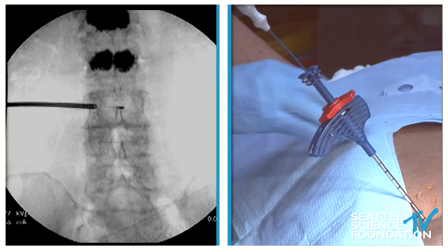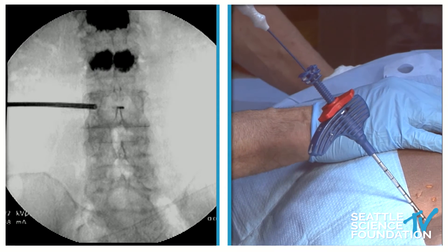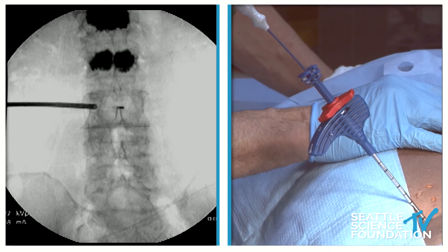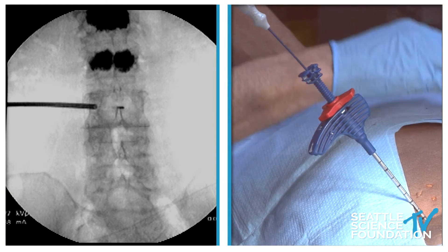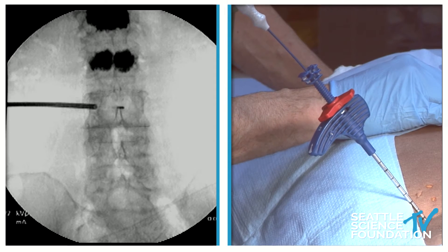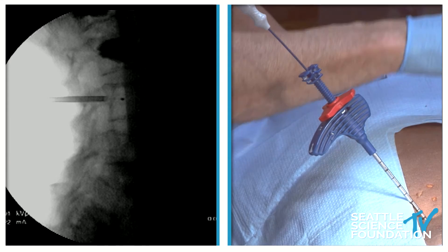The position of this is right in the center of the vertebral body on the anteroposterior portion — equal distance between the top and the bottom, superior and inferior end plate. It's at least 60% of the way back; we actually hit about 70%. So the basal vertebral nerve terminus will be located all the way to the back.